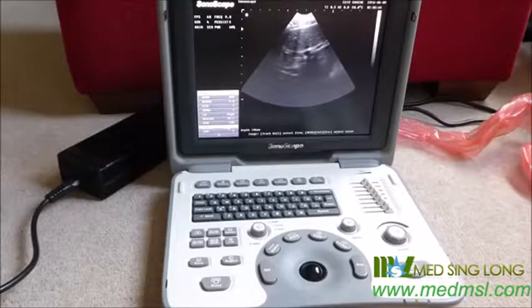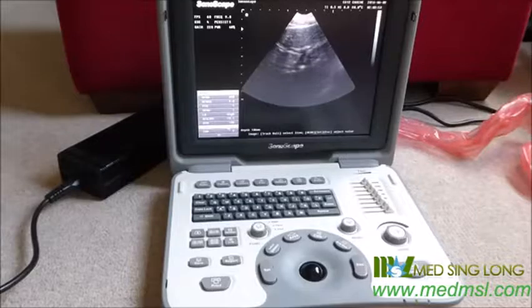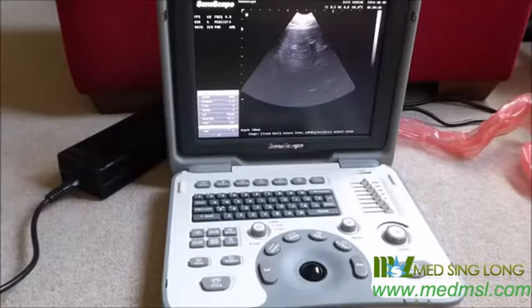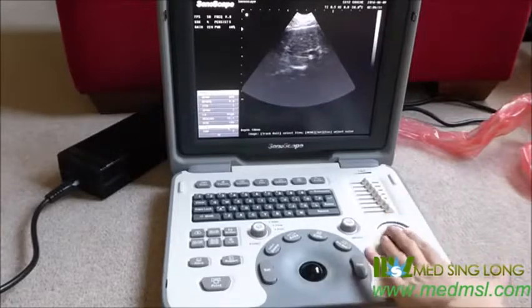Similarly, some people have dogs that just fall asleep when they're scanning, and you might be able to change the persistence so that you get a really beautiful image and there's not much movement going on, so you're not going to encounter any problems with a sort of a laggy or unresponsive image. So that's another thing you can play with eventually. But to start with, to try and keep it simple, I would just practice using your gain. Use that every single time you scan.